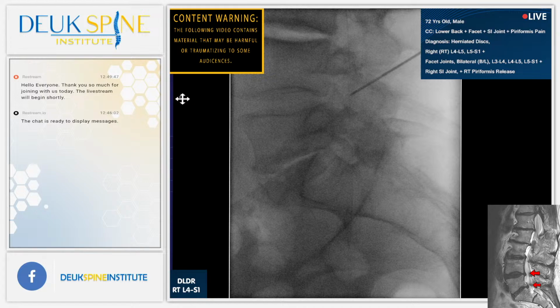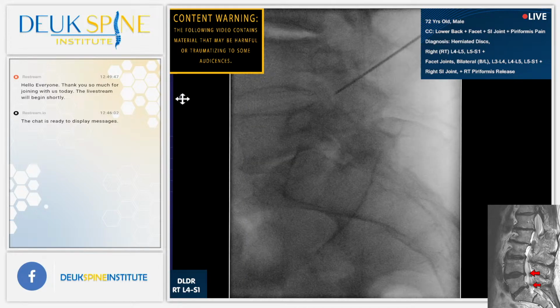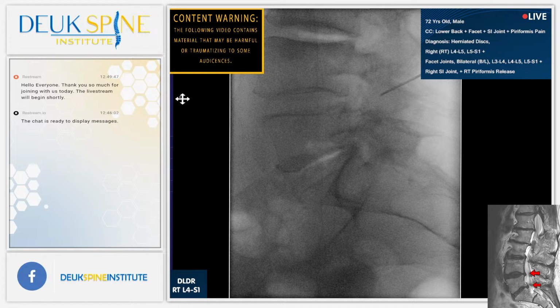More. Is it? Yeah, it is worse. Try the other way. That's better. That's good. That's as good as we're probably going to get. So let's keep it there. Shot.